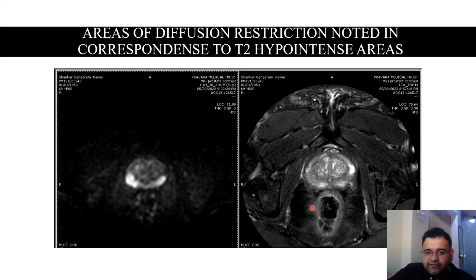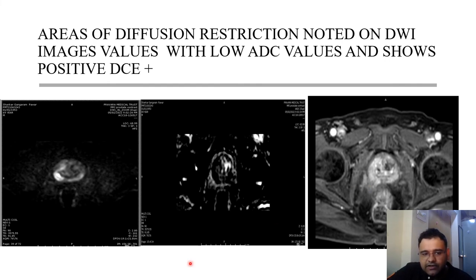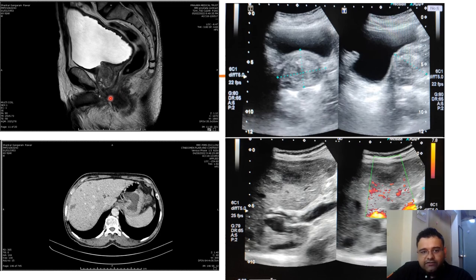On T2 weighted axial imaging, a T2 hypointense signal showed corresponding areas of diffusion restriction on DWI images. The T2 hypointense area showed diffusion restriction with low ADC value and positive uptake of contrast on dynamic contrast imaging. This lesion was categorized as PI-RADS 5 and on histopathological examination proved to be adenocarcinoma. The PSA of this patient was more than 100 and the patient also had skeletal metastasis. The patient had enlargement of the prostate with obstructive uropathy symptoms and T2 sagittal images also showed mucosal irregularities involving the urinary bladder.